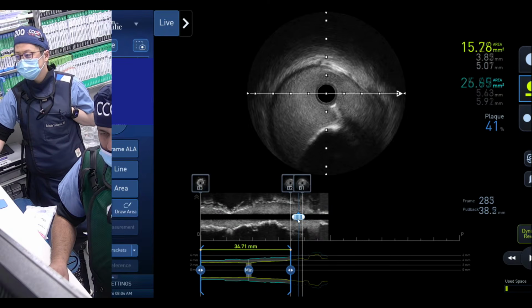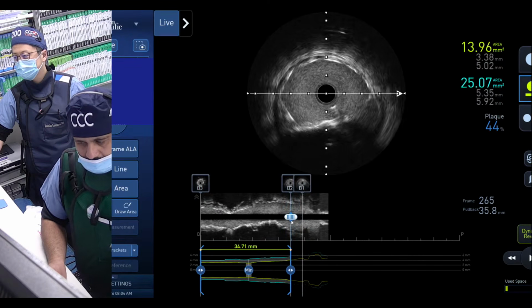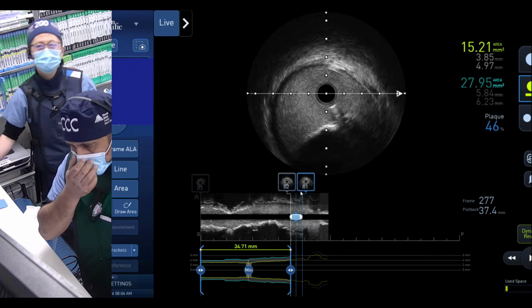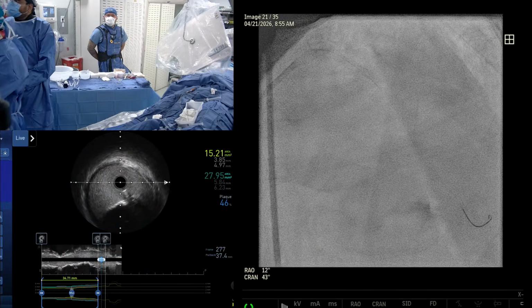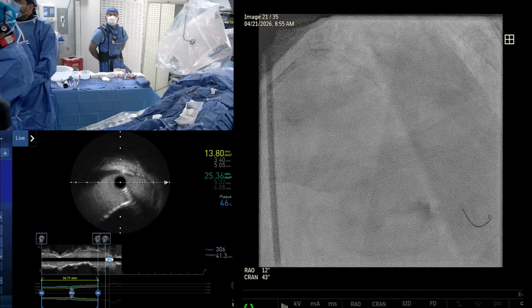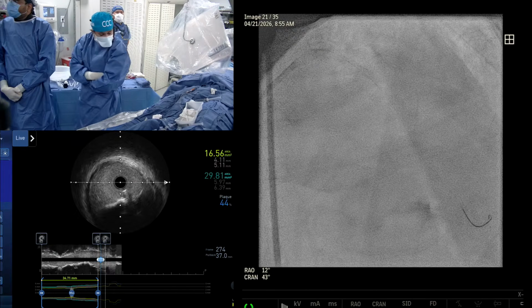So Anu, then what did you do? Another stent? I did not. Question is, do we stent or leave it? Yeah. Go back to the angio. Oh my God. The only thing is, if we had not used IVUS, I would have just gone with the 4.0. You know, I would have done the 4.0 by 8 millimeter. But now with the 4.5, I don't know, we might have created this. Yeah. I would have gone with the 4.0.